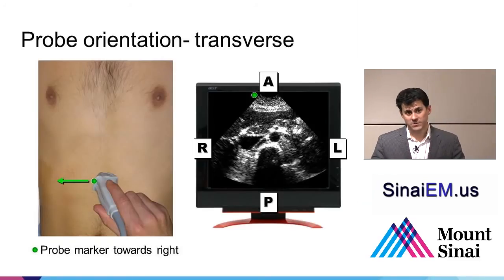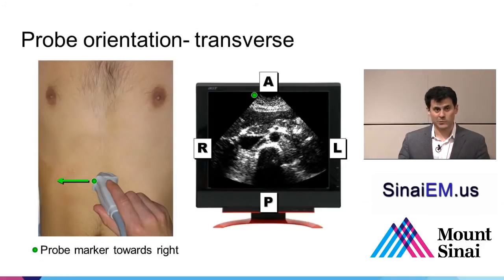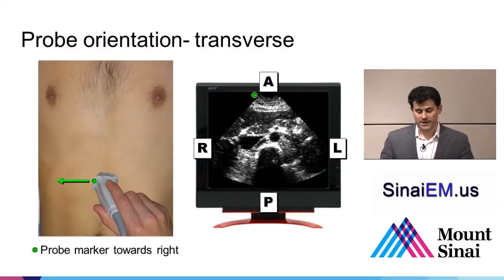And in the case of the transverse plane, you might be able to appreciate that this liver, inferior vena cava, aorta, lumbar spine would actually overlap really nicely into a CT scan image of the same area. So it really sets your imaging up nicely as if the patient is laying with their head facing away from you or behind the screen and their feet coming out of the screen towards you, just like a CT scan image would be done.